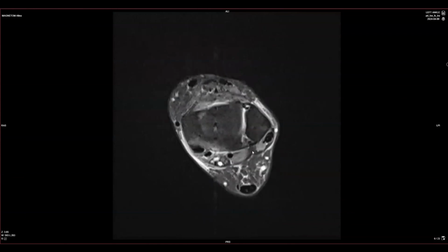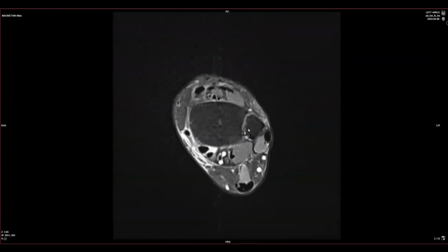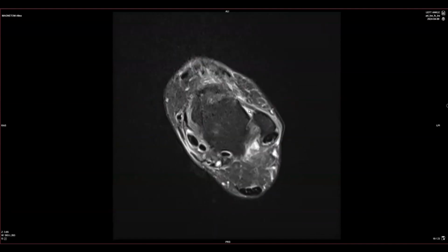Let's go to the lateral collateral ligament complex. Our syndesmosis, nice posterior, anterior, interosseous ligament region, not widened, probably around 2 millimeters.